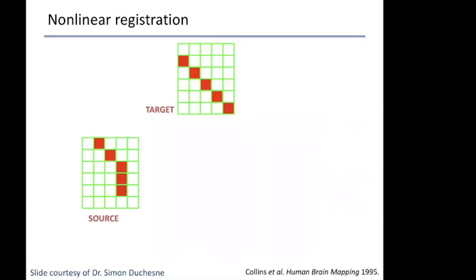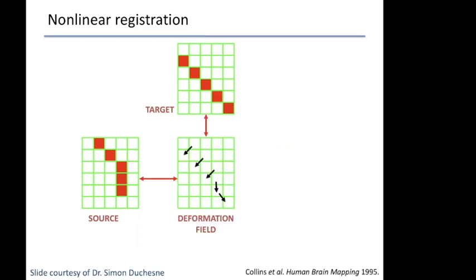The other thing you might have heard a lot about is the idea of nonlinear registration. That is the idea of normalizing images, so you take away some of the underlying neuroanatomical variability. So, for example, we're going to talk in terms of a source image and a target image, and the idea is to map our source image to look as much like our target image as possible. And so in this particular case, instead of looking at global differences, you're going to look at ways to push, pull, stretch, compress different parts of the brain, so you can get the best matching possible between images.